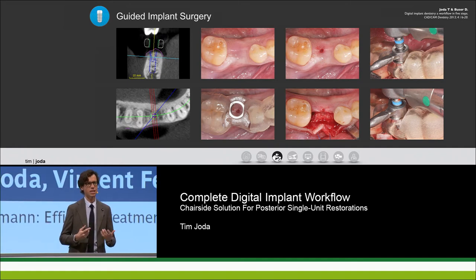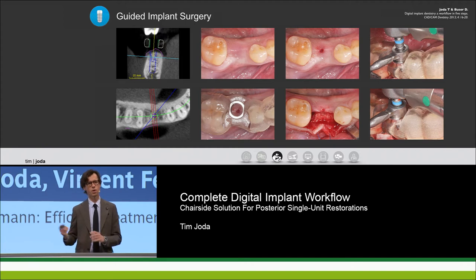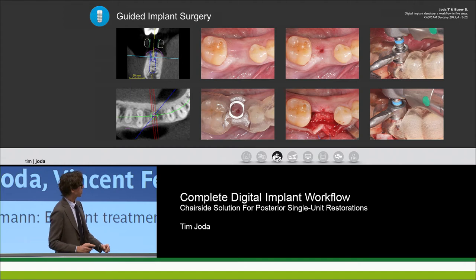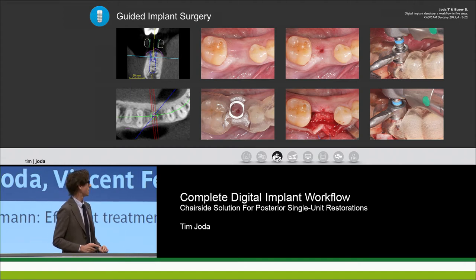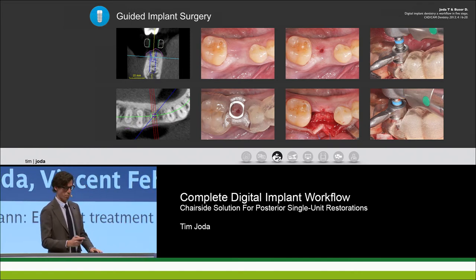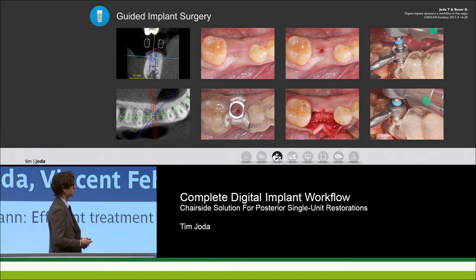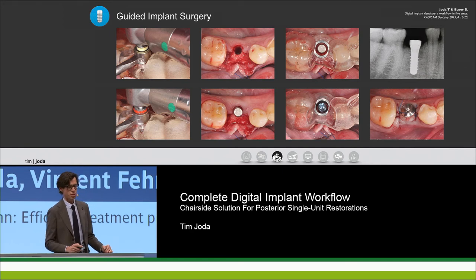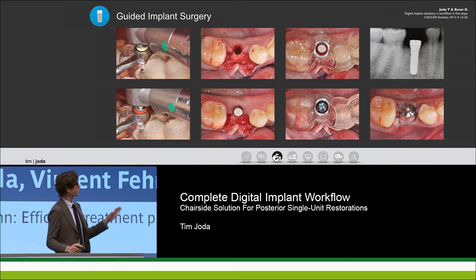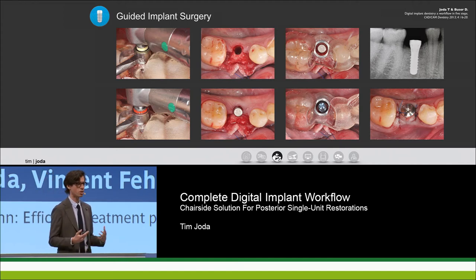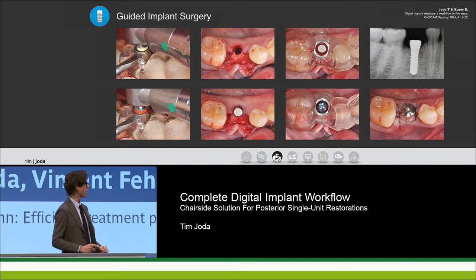This is important at our clinic at the University of Bern — we have interdisciplinary team interaction throughout. Here you see a minimally invasive treatment: just raising a small flap, then proceeding with a fully guided procedure using pilot drills. Subsequent slides show the drilling sequence, the final implant positioning, the x-ray, and transmucosal healing — straightforward without any GBR procedure.